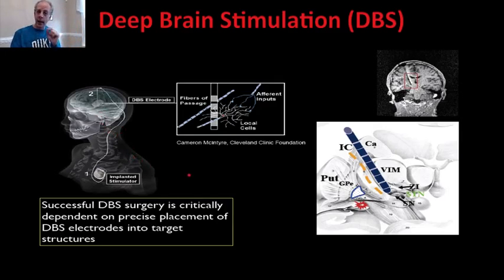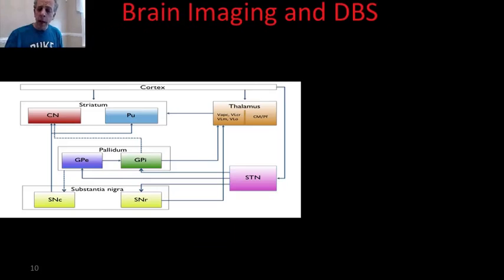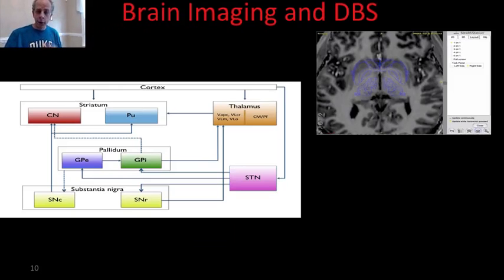Now, the big challenge here is to find the target, to find where you want to put that electrode. That is normally done with the help of a number of components, two of them being a model. Brain neurosurgeons know the literature, and they have a model of the different regions in the brain, and some are expressed here in a schematic way.